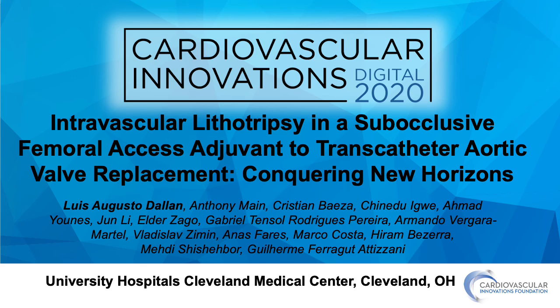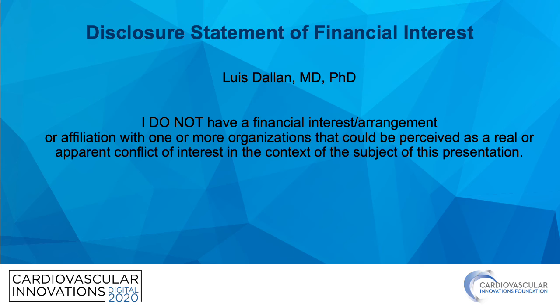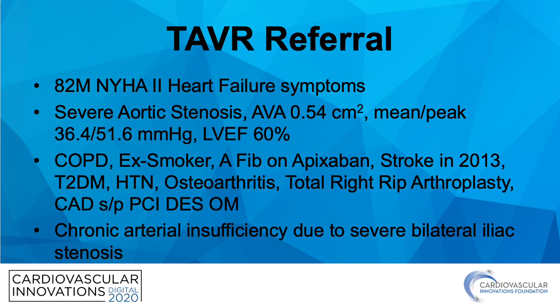I'm a physician from University Hospitals Cleveland Medical Center, and on behalf of the structural heart team led by Dr. Guilherme Attizzani, I would like to present a clinical case of intravascular lithotripsy with Shockwave in a subocclusive femoral access, adjuvant to the transcatheter aortic valve replacement, conquering new horizons. I have no conflicts of interest with this presentation.